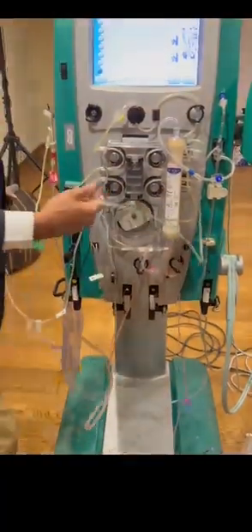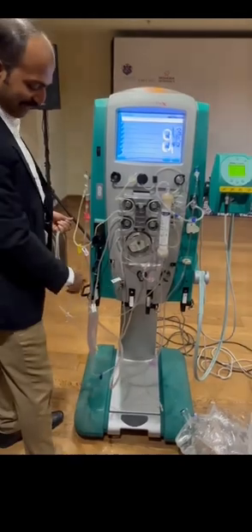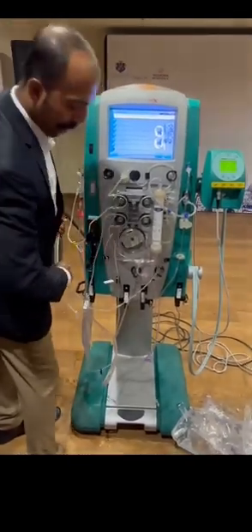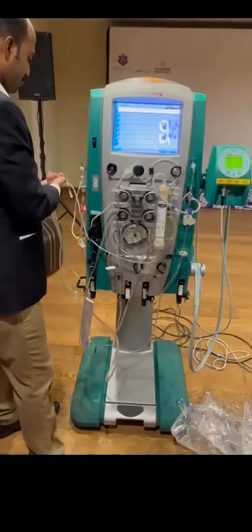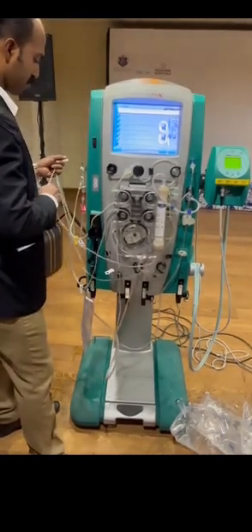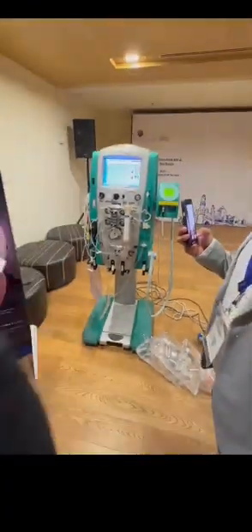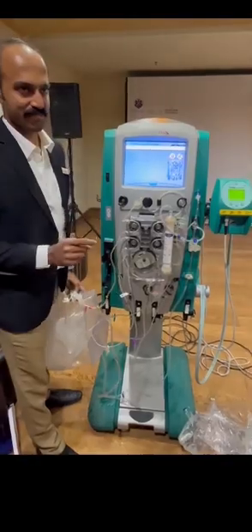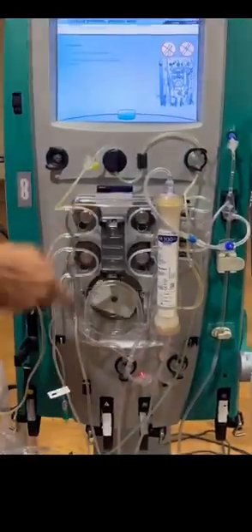So if it is a new filter, we are not going to worry about priming, just click on it, because it's already primed, with saline in this. So you have to open this. Take a cover from here. If it is a new filter, no need to keep it like this, because it is already primed and has saline in it.